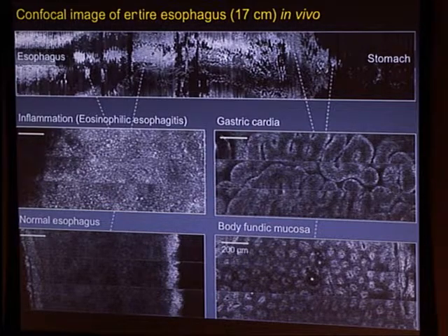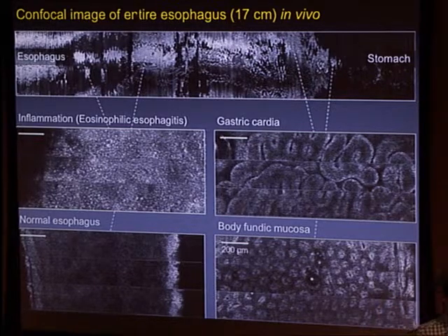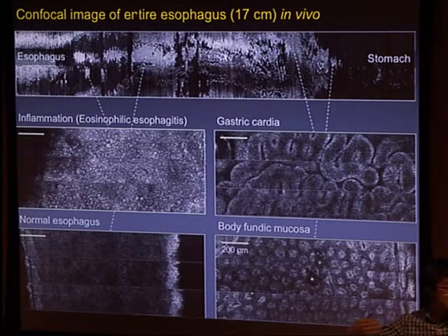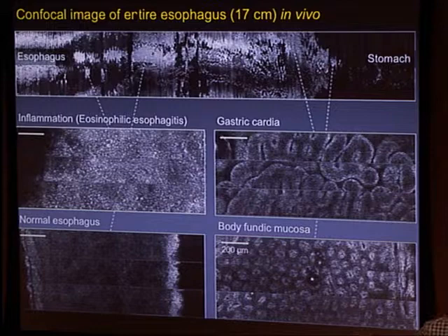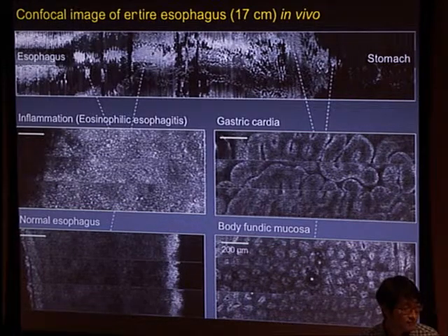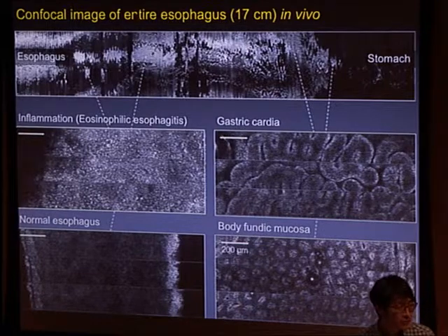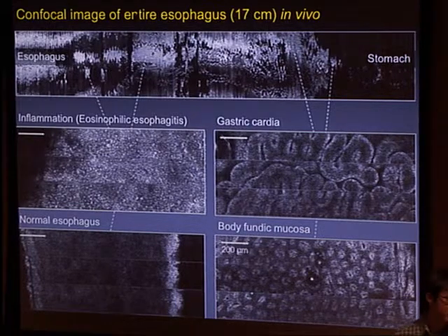Yeah. So it's kind of a flipped approach compared to conventional spectroscopy, where you have a spectrometer outside. But now we have a spectrometer inside, and then spreading out, but also outside we have a spectrometer to analyze it. So when you record that spectrum, which represents the 280 microns, right? Is there any reason you need to channelize that, or do you just keep that as an analog picture? It's just an analog picture for now.